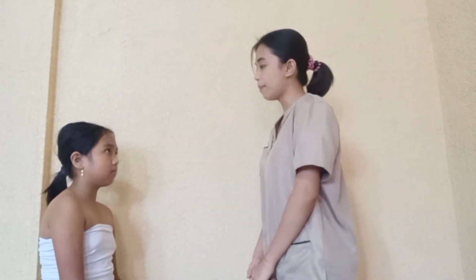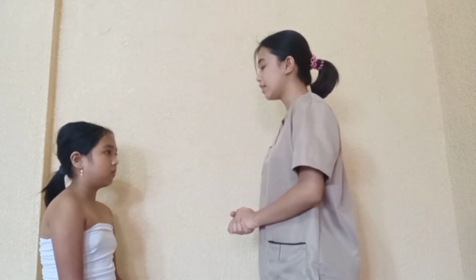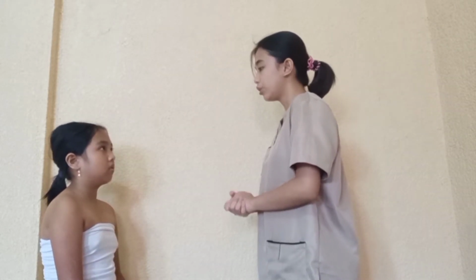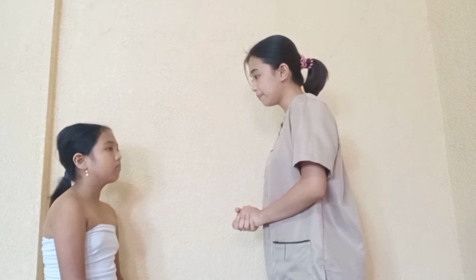So good morning, ma'am. My name is Irish Dalian, your student nurse for today. And today I will be assessing your body temperature through your ears, mouth, armpit and through your rectum. So is that okay for you, ma'am?